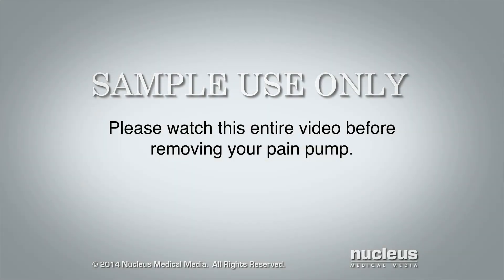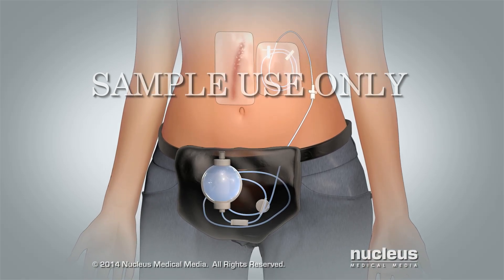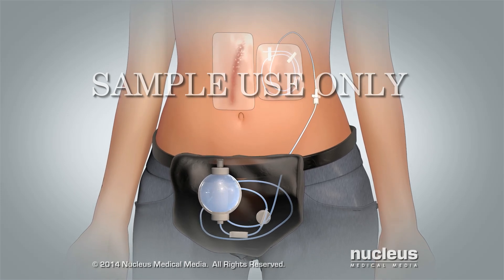Please watch this entire video before removing your pump. This video will teach you how to tell if your pump is working, how to care for it, and how to remove it.